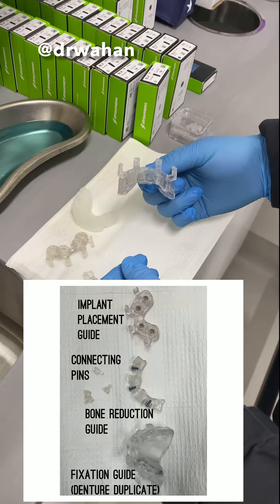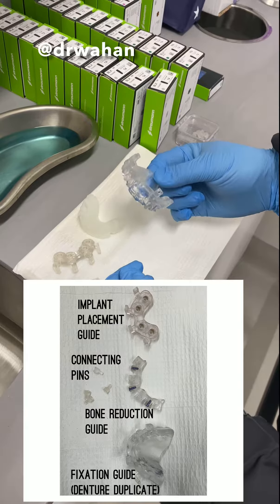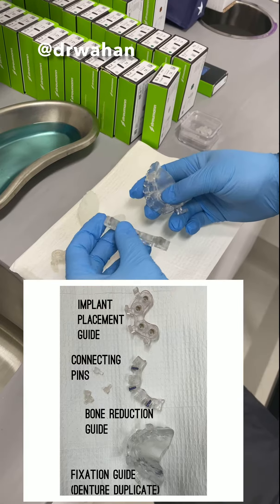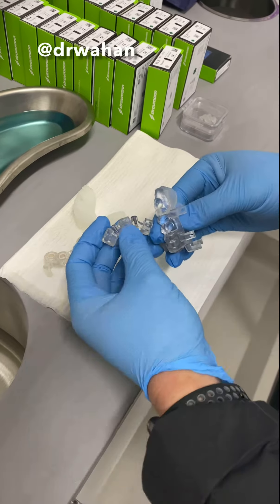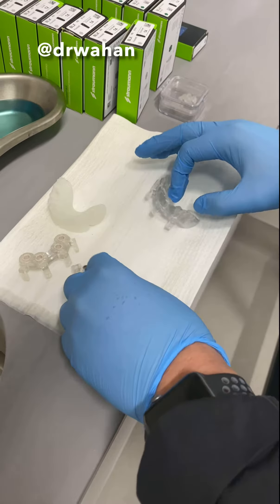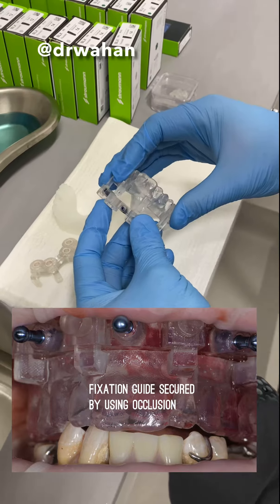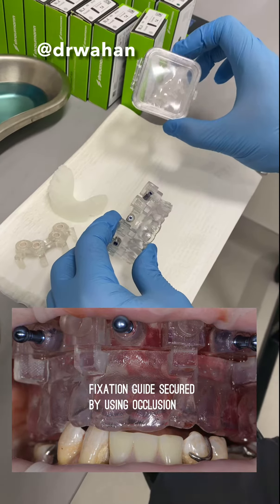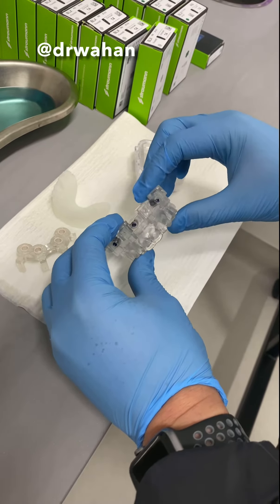This is the fixation guide. It's a duplicate of the radiopaque denture. So this stacks to this, which is the bone reduction guide, with three Stroman anchor pins here. This just snaps here into these slots like that, and then these connecting pins connect these two things together.